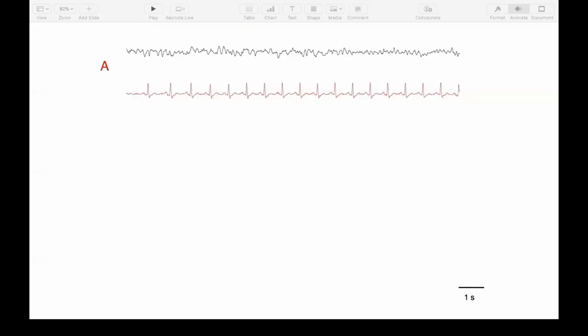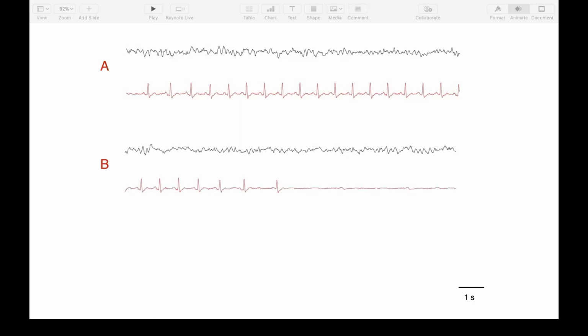And what is shown here is an observation in a human, in a patient that was referred to our department, showing an EKG in red and above it in black part of an EEG, just one channel. Left to right is 10 seconds. And we see a nice alpha rhythm amongst others in this recording. And it happened that in this particular patient, who was referred for either syncopes or seizures, during the EEG registration there was definitely an abnormality in the electrical activity of the heart. In fact, there was a complete cardiac arrest.